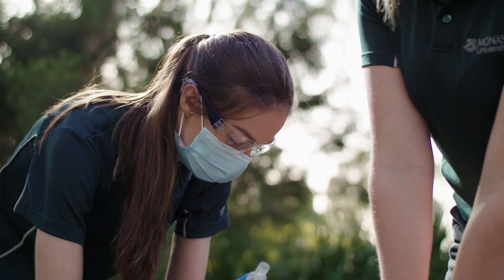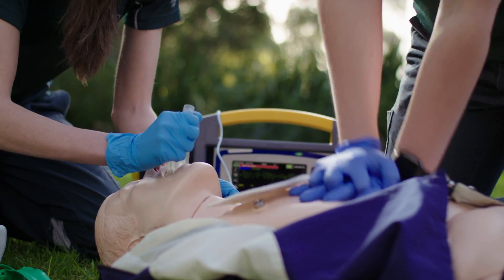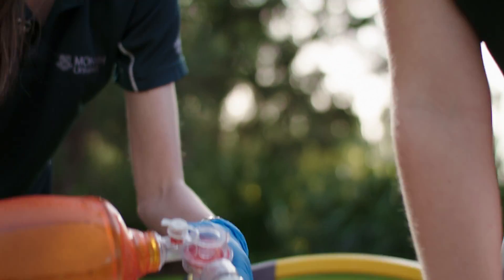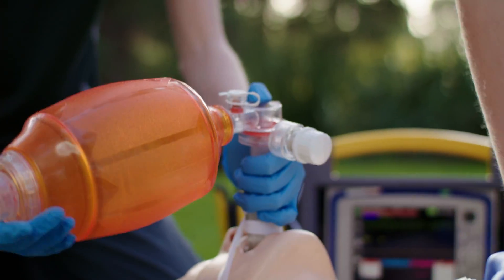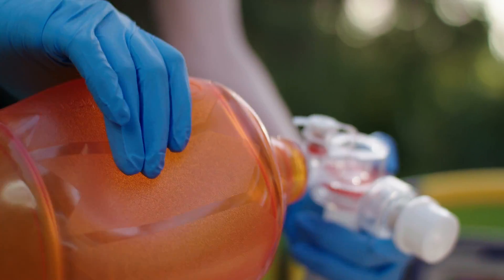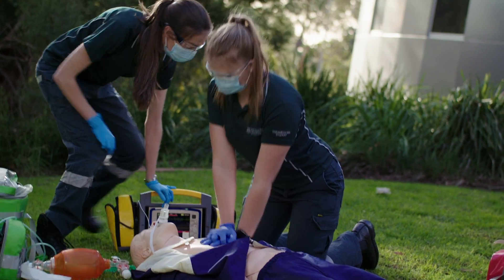Next we insert an advanced airway. This means we can apply oxygen to the patient while compressions are happening at the same time. The compression to breath ratio would be 15 compressions to one breath. However, we don't need to stop compressions as the airway allows us to directly give oxygen into the lungs.